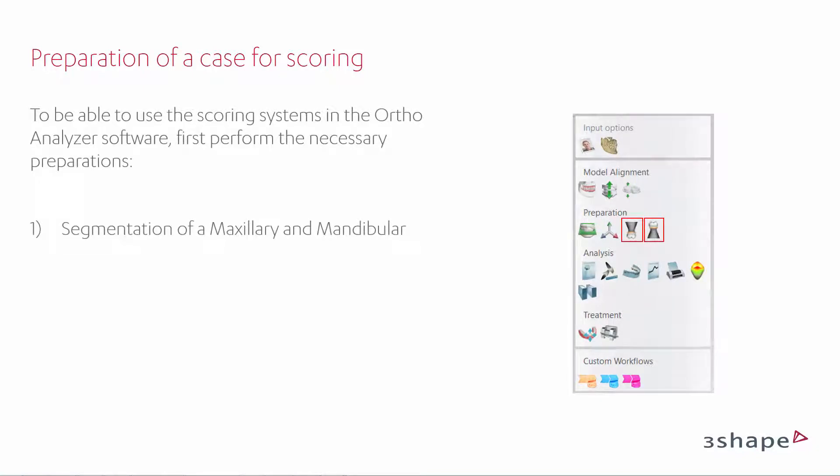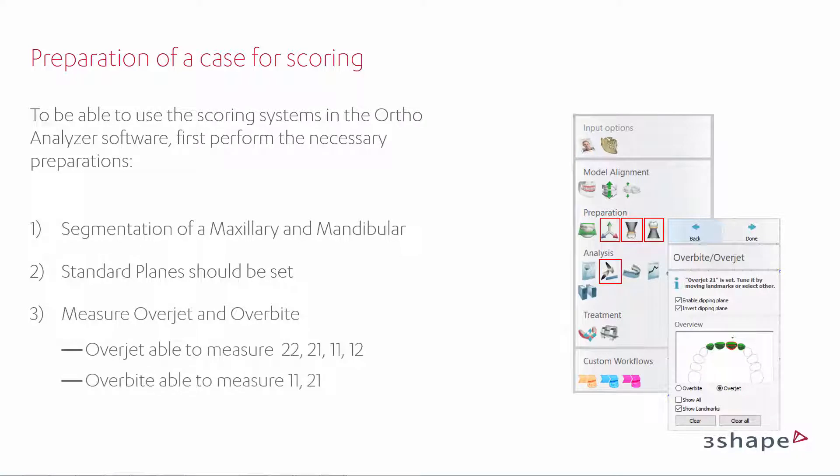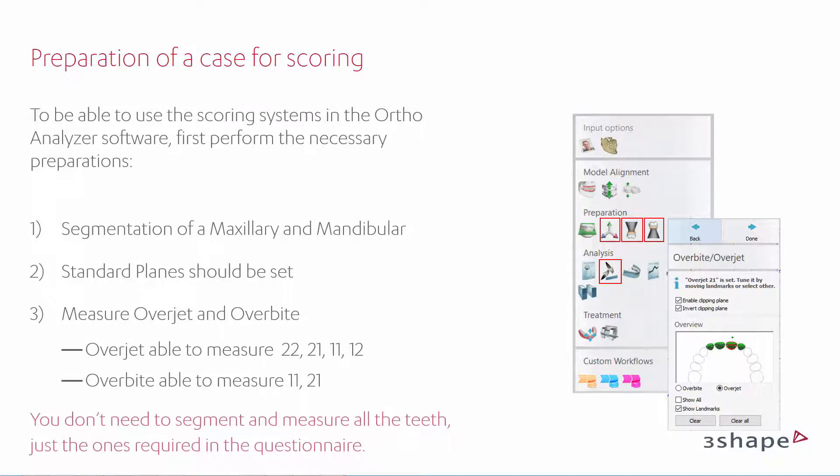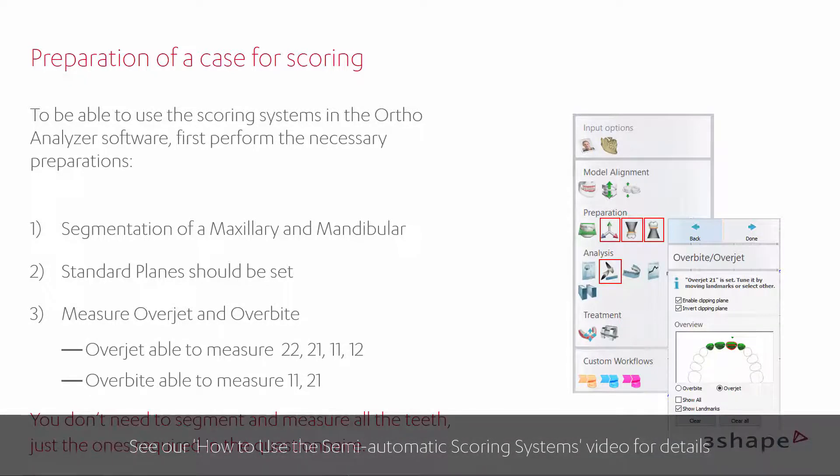Perform segmentation of maxillary and mandibular. Set the standard planes. Overjet and overbite should be set for the four anterior teeth and the two incisors respectively. Please see our scoring system introduction video for more details.